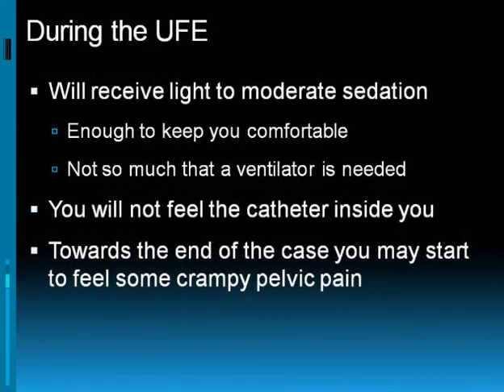During the UFE, you receive light to moderate sedation. This is a combination of fentanyl, which is a narcotic pain med, and Versed, which is a sedative. And the idea is to keep you comfortable, almost in a twilight type state, but not fully, totally asleep.